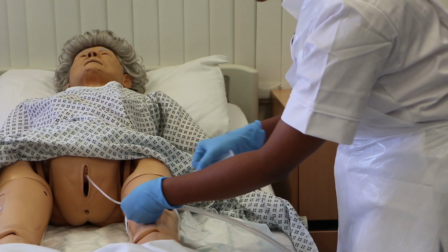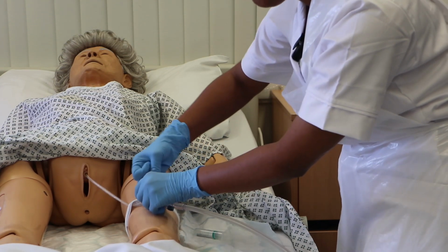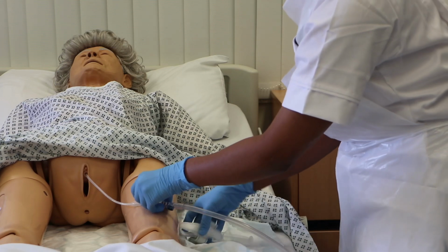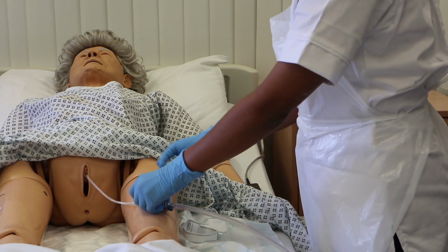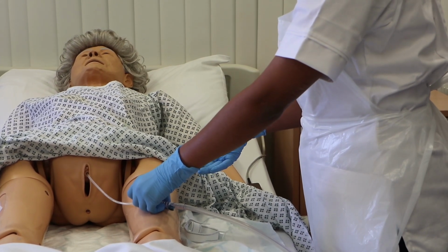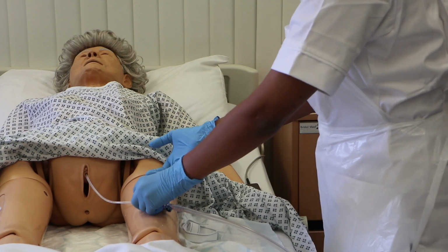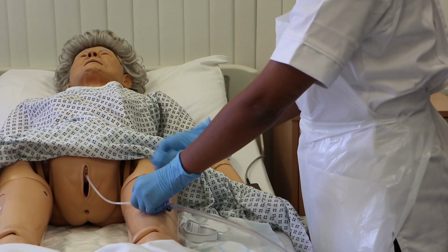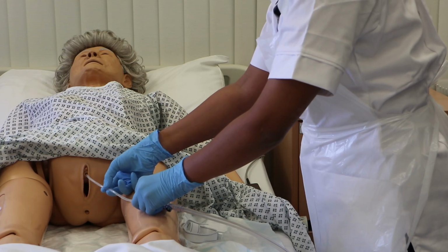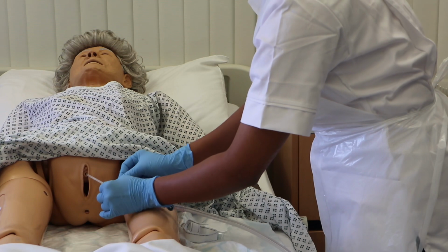Okay, I will remove the syringe, and I am removing the leg strap. Okay, are you still comfortable, Grace? Yeah. Okay, now can you please take a breath in and breathe out? Okay. Okay, and can you please do it once again? Okay. While you are exhaling, I am removing the catheter by giving a gentle traction. Exhale, please.